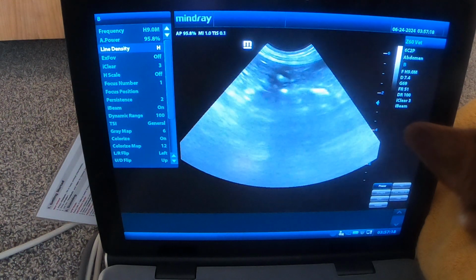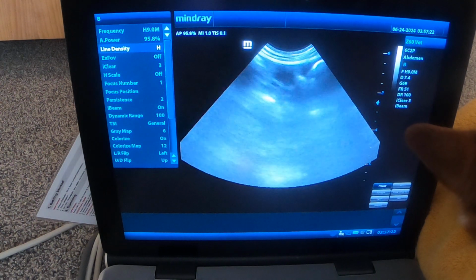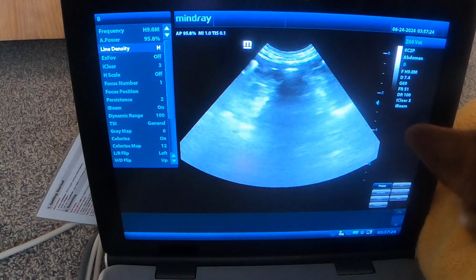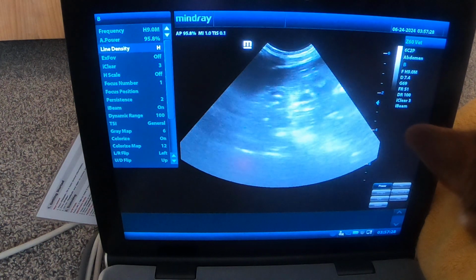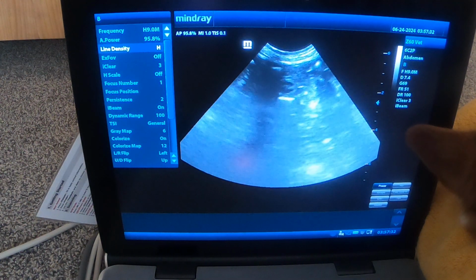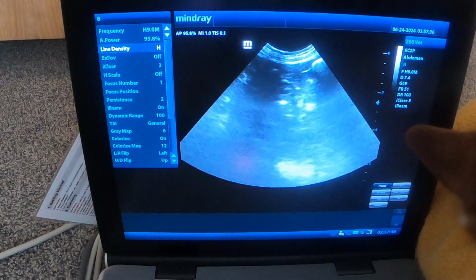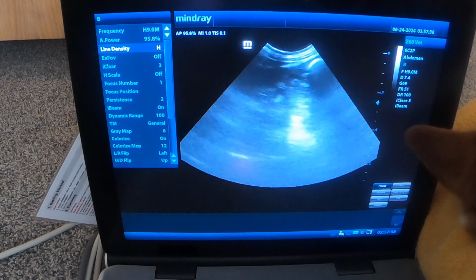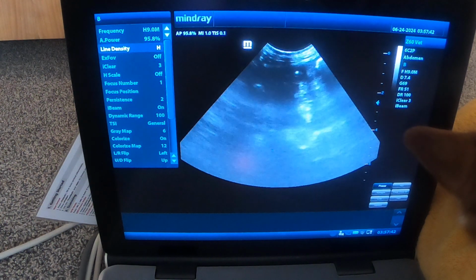All right, perfect, everybody. So just those 4 views, practice it a little bit, and then you guys will become professionals. If you're looking and you can't find the organs you're supposed to, revert back to what you know about anatomy and look at the abdomen too. See where you're pointing your probe, making sure you're not missing where it's supposed to be. We know the spleen is on the left-hand side and superficial. We know the liver is sitting up underneath the xiphoid, pointing that probe cranially.